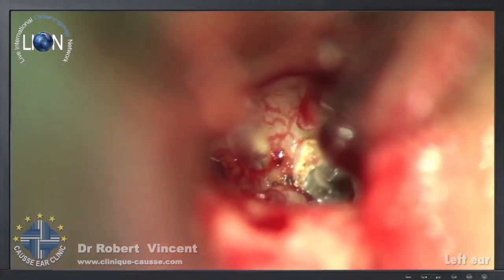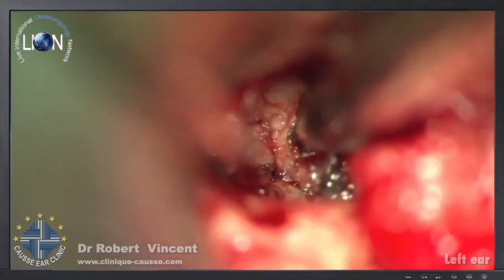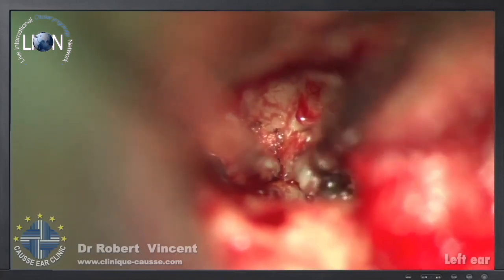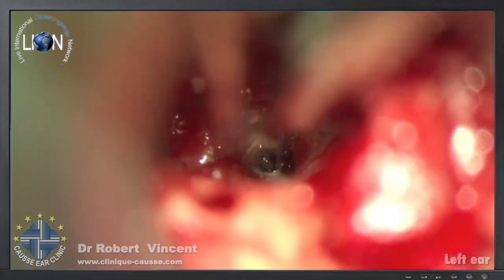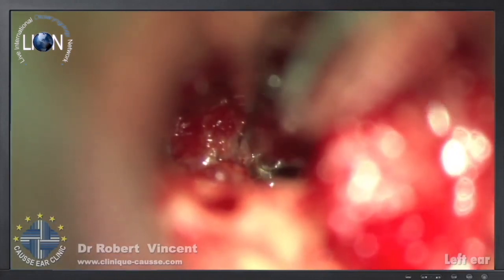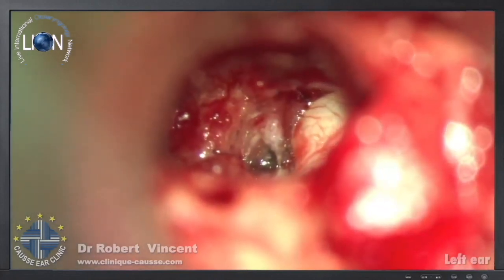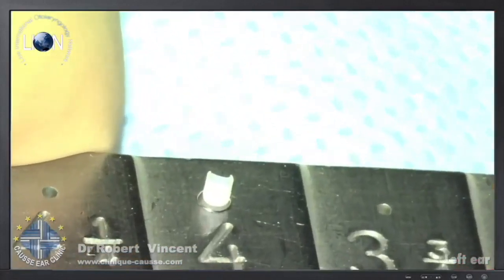And after having removed the superstructure, I will drill out the promontory strictly perpendicular to the promontory. That's important to make it like this until I enlarge the approach to be able to have a nice view of the footplate. And then you can see that I can perform safely a stapedotomy. Then, of course, this will be followed by the same step, the vein graft into position.